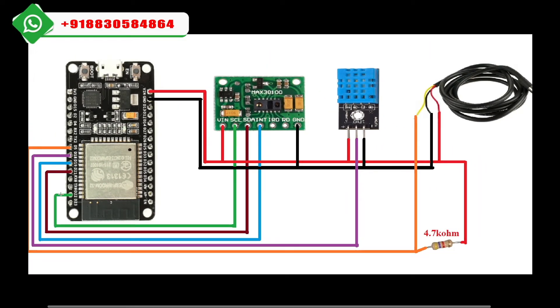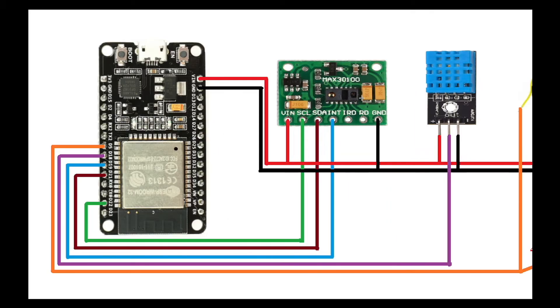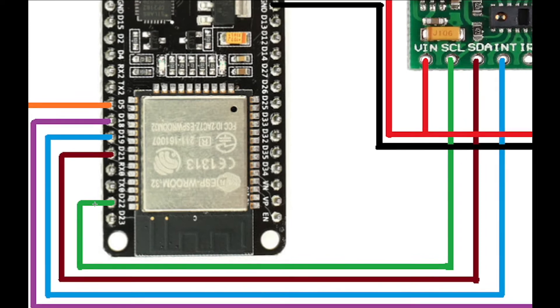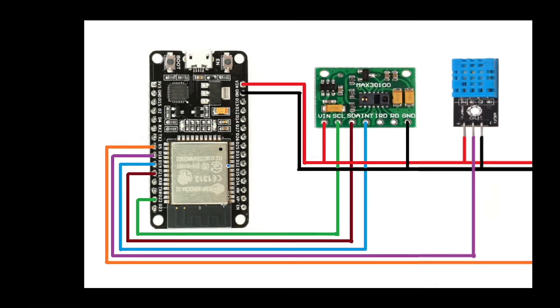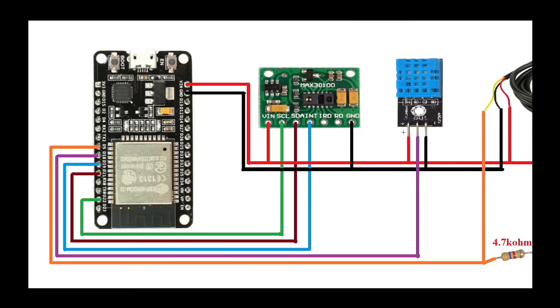The SCL and SDA pins are available on the ESP32. The SCL is connected to pin D22 and the SDA pin is connected to pin D21. The INT pin is connected to pin D19. D22 and D21 are the SCL and SDA pins on the ESP32.